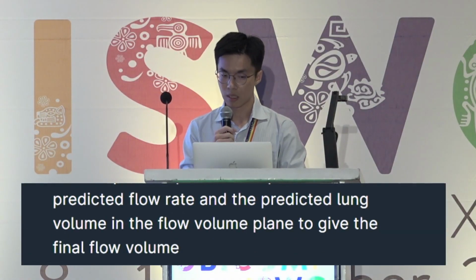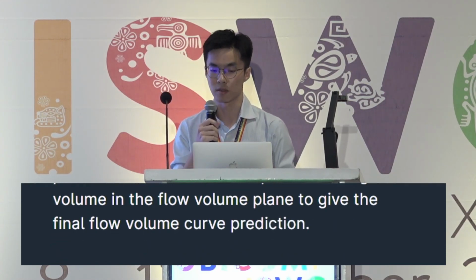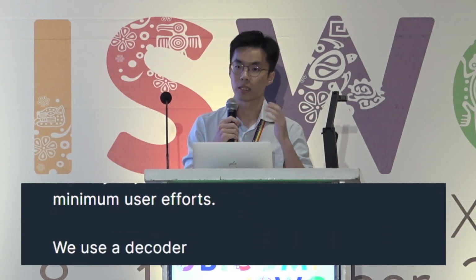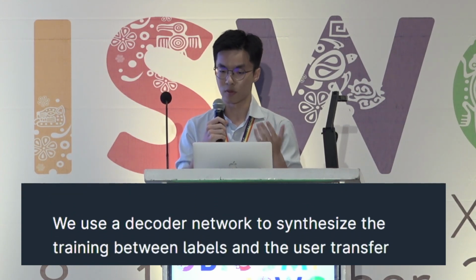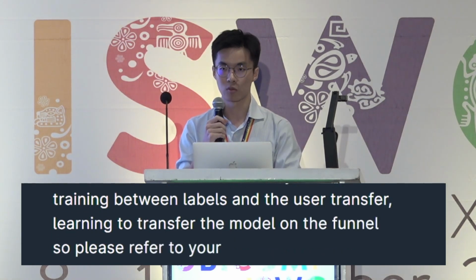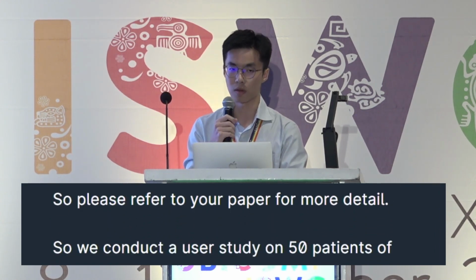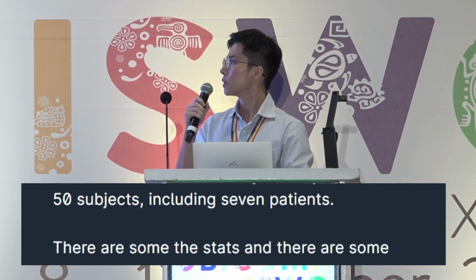And in addition to that, we enable EarSpiro on daily objects such as a funnel with minimum user effort. We use a decoder network to synthesize the training labels and use transfer learning to transfer the model to the funnel. So please refer to our paper for more detail. We conducted a user study on 50 subjects, including 7 patients. Here are some of the stats, and there are some other examples.